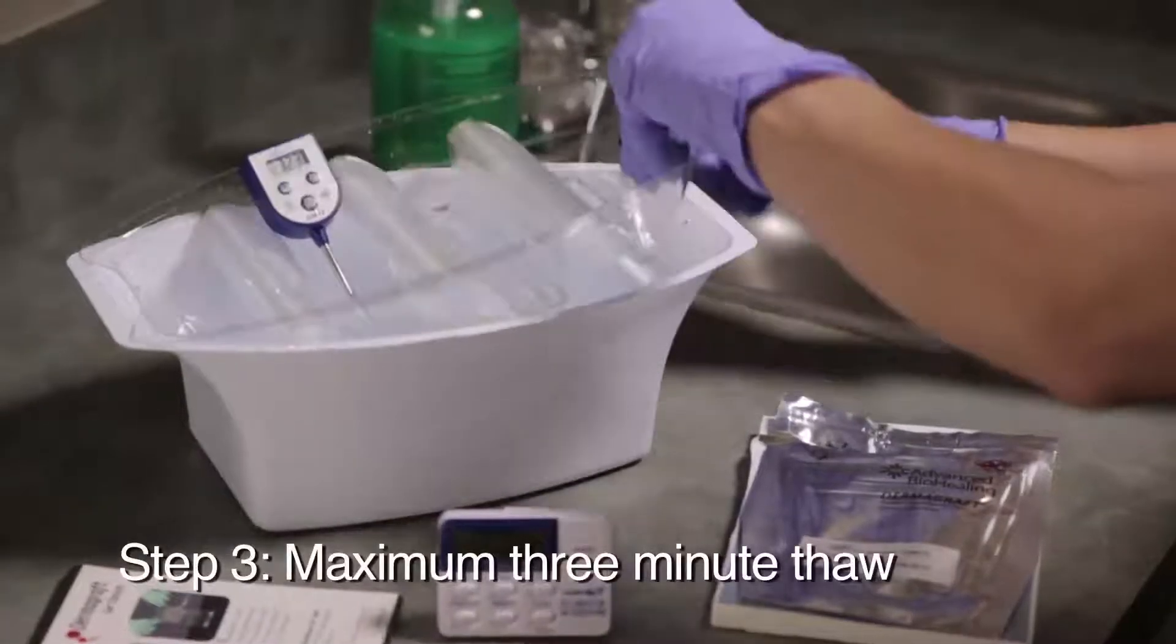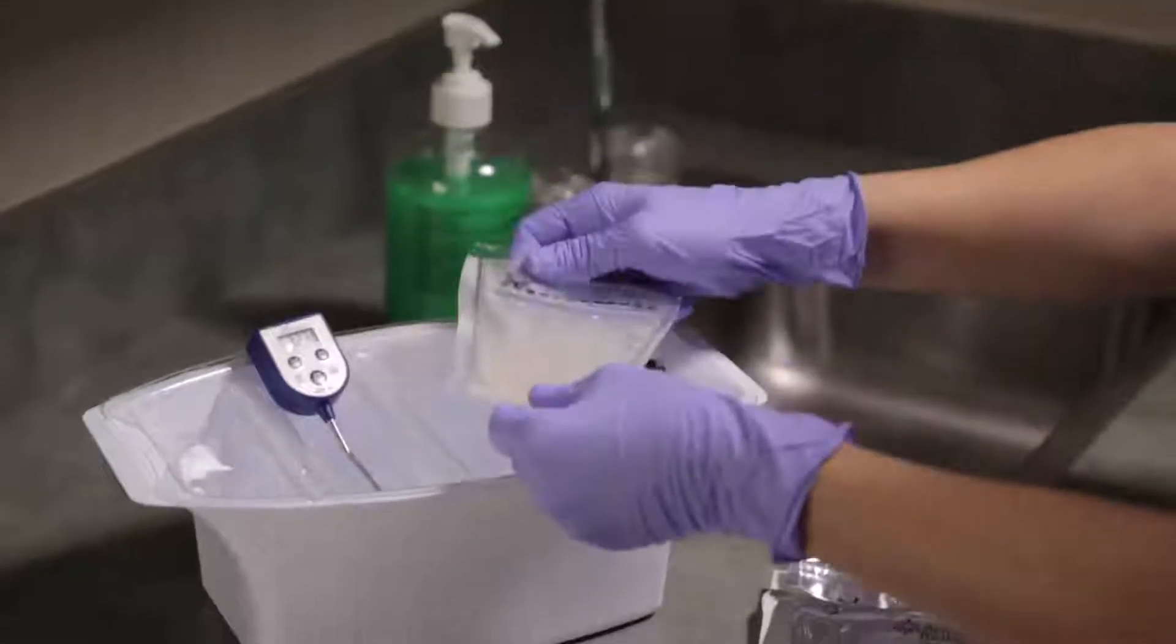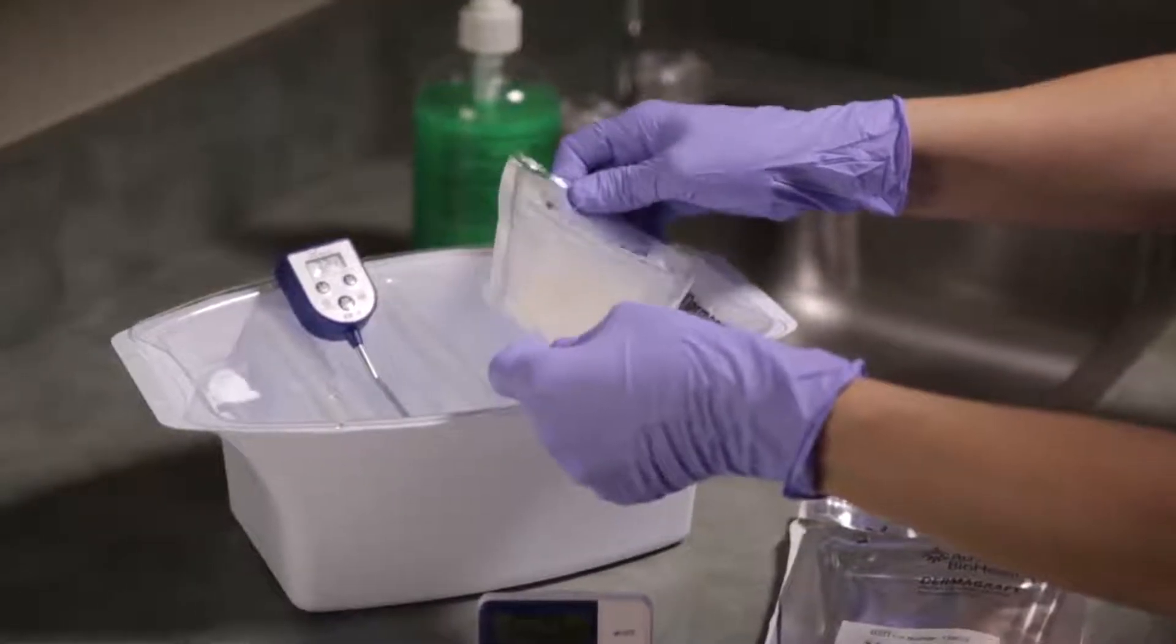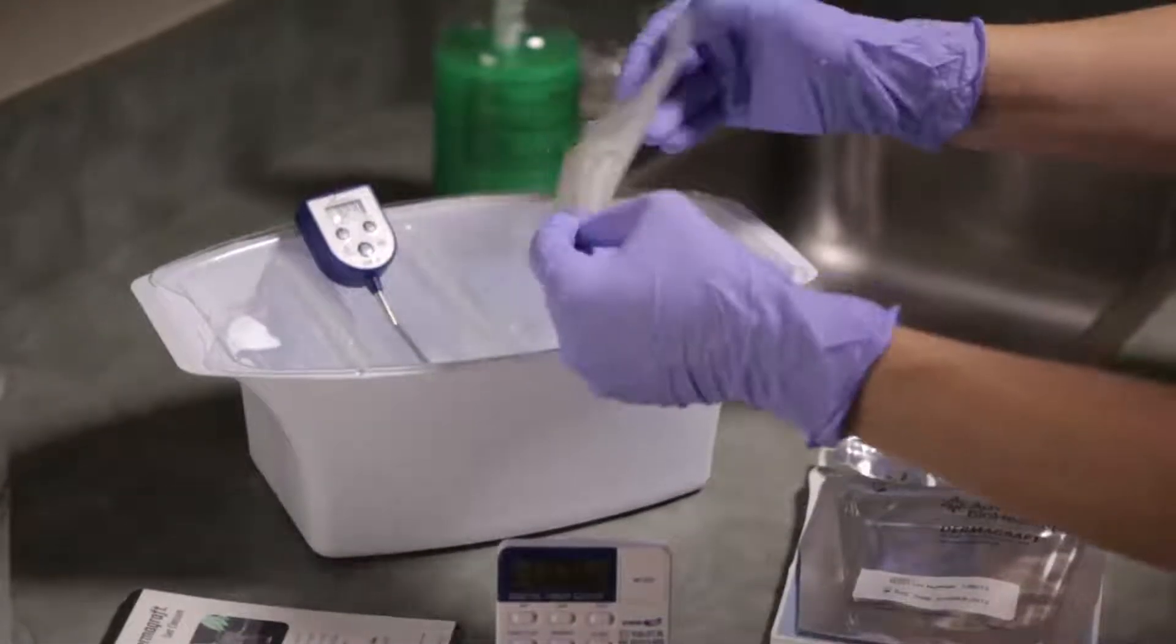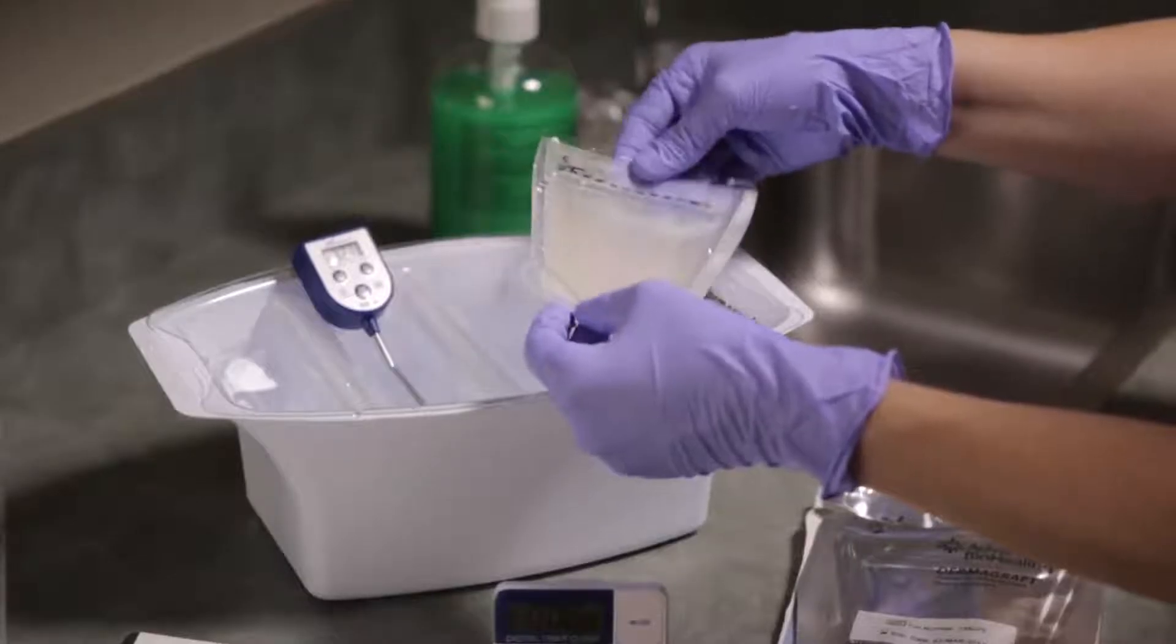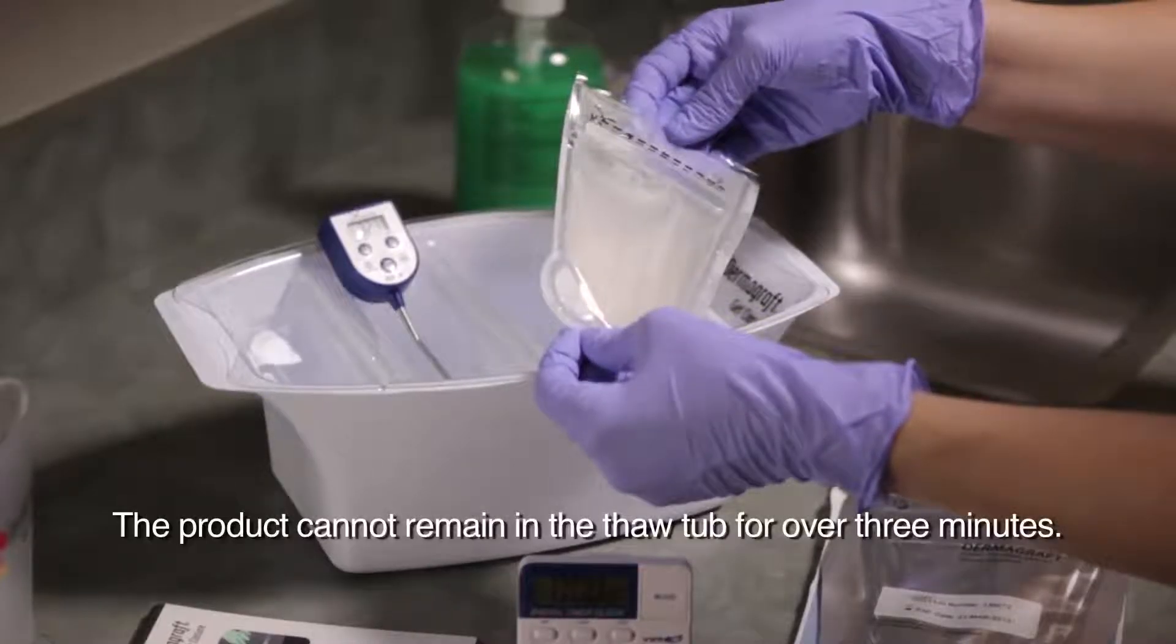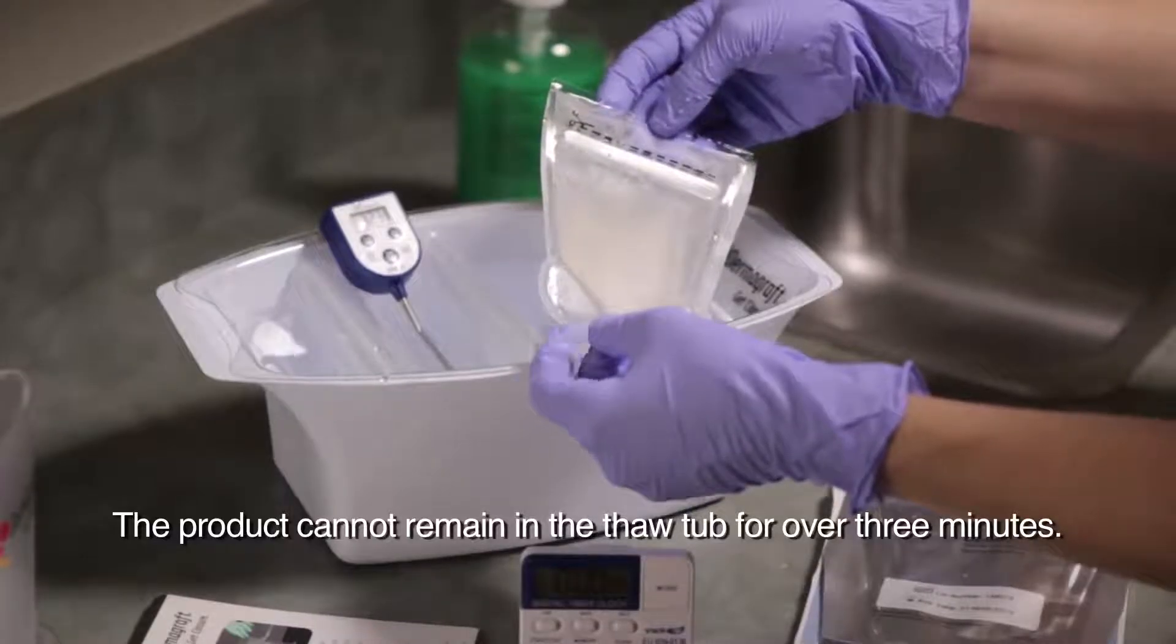Step 3: Maximum 3-minute thaw. When the timer alerts you at the end of two minutes, remove the Dermagraft from the tub, handling it from the corners. Look to see if there are any ice crystals floating inside the pouch. If you see any ice, place the product back into the water tub for another 15 or 20 seconds. This should be sufficient, but keep in mind that the product cannot remain in the thaw tub for over three minutes total.